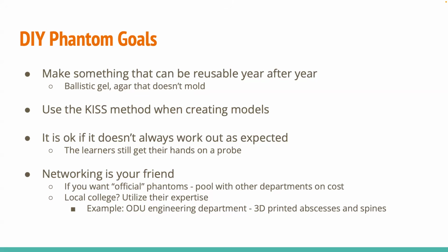And then networking is your friend. If you do want official phantoms, pool with other departments. We have not done this yet, but our ER actually partnered with Old Dominion University, their engineering department. They were able to 3D print some spines and some abscess molds to create abscesses. So utilize those resources as well, because they are always looking for projects and things to help out with.